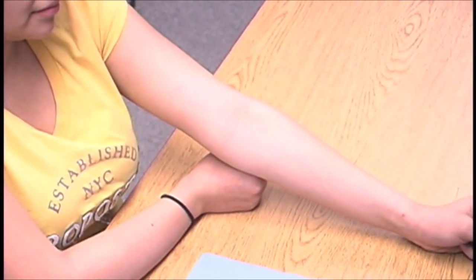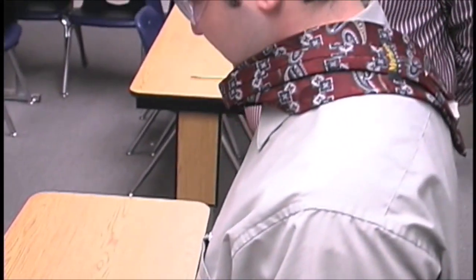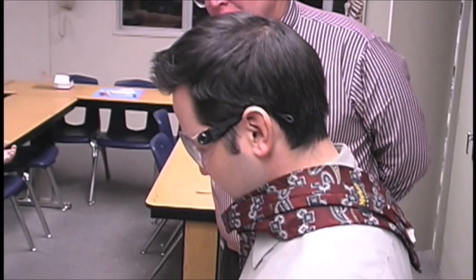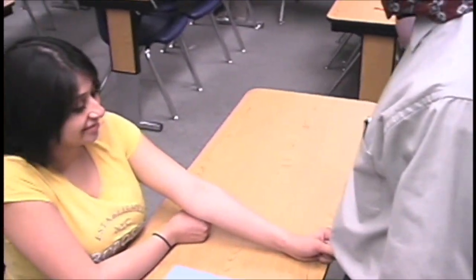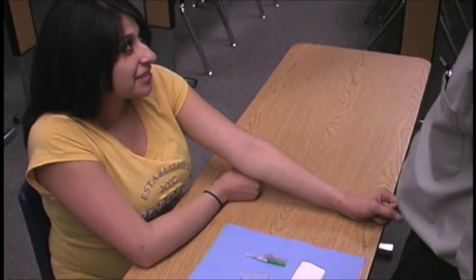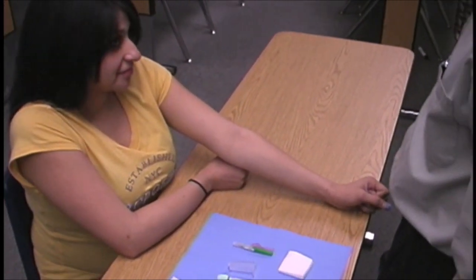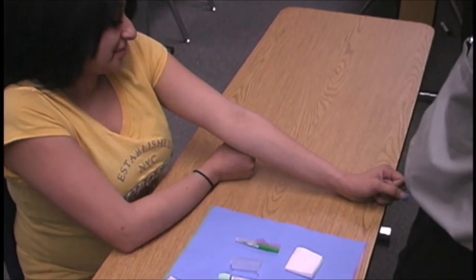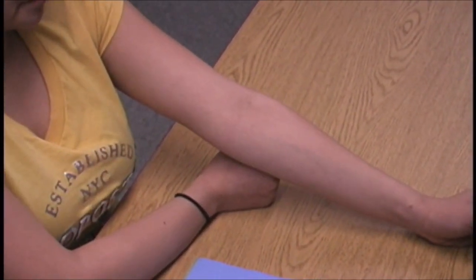We have our typical setup again with Al Garza and Veronica Martinez. We're going to watch Al do a venipuncture on Veronica. Notice that she is scooted very close to the table, her arm is in a slightly downward position, and her fist is under her elbow. We have already properly identified the patient.